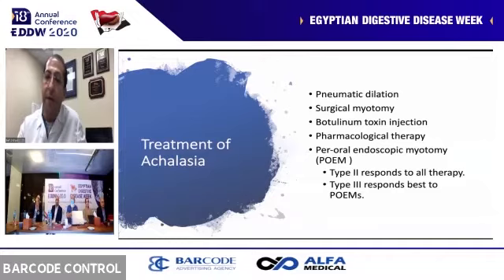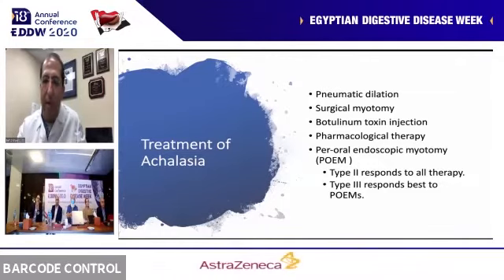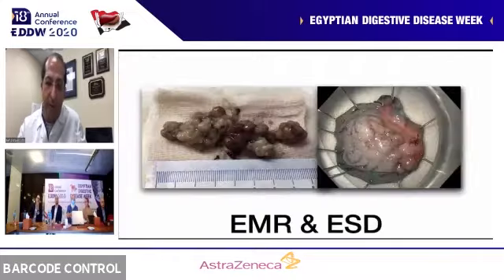Pharmacological therapy with medication has never been proven to work very well. It's maybe something that the patient would use intermittently, calcium channel blockers, sublingual nitroglycerin. It's never a long-term therapy. And then we're going to talk about POEM, or peroral endoscopic myotomy.